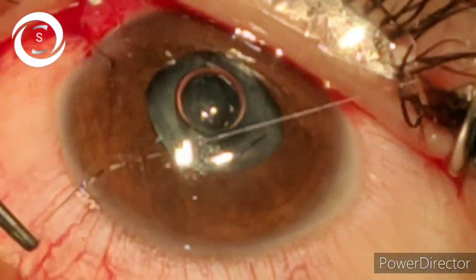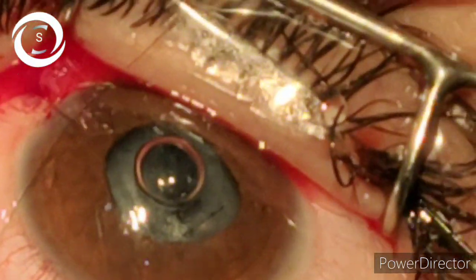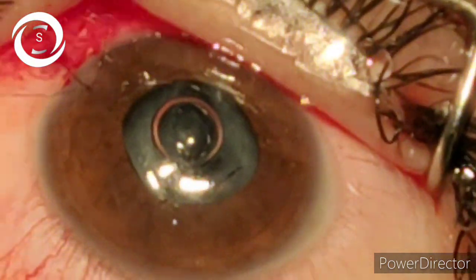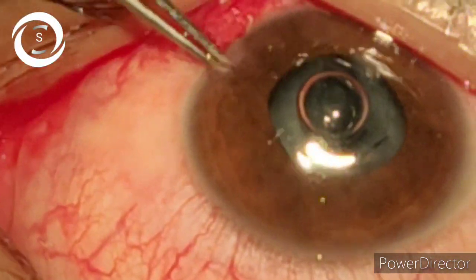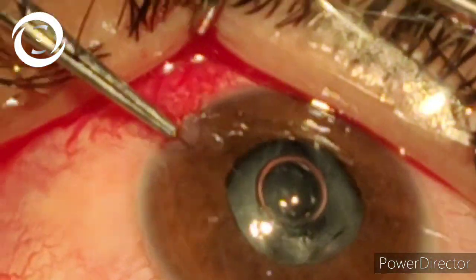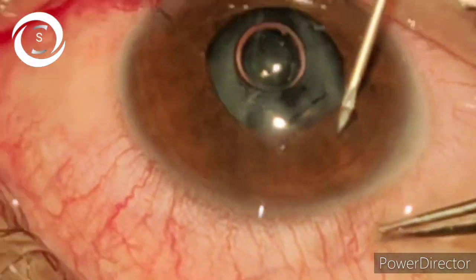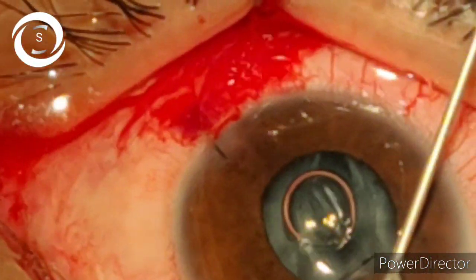Now I am applying one suture to seal the side port that I have made. In order to check whether the anterior chamber is well formed, I put air in and it stayed — it means the wound is well secured.